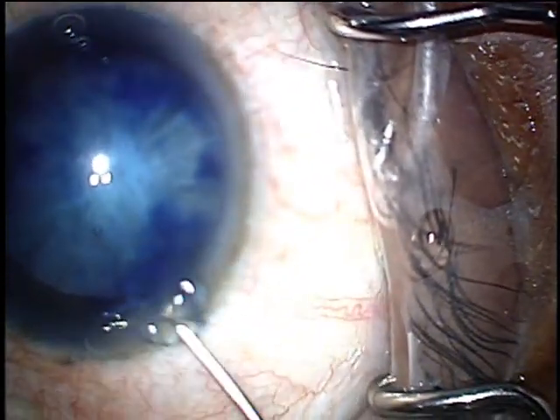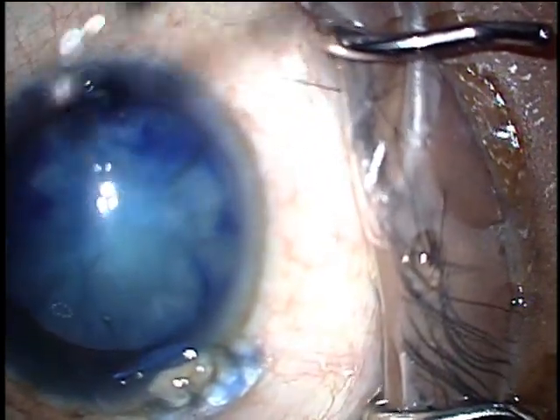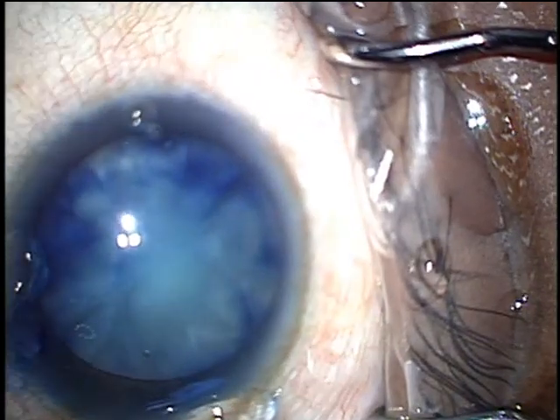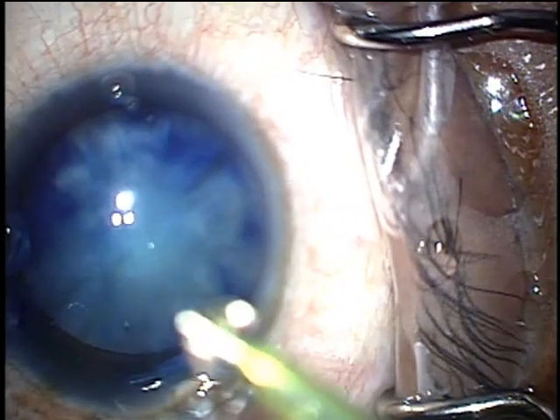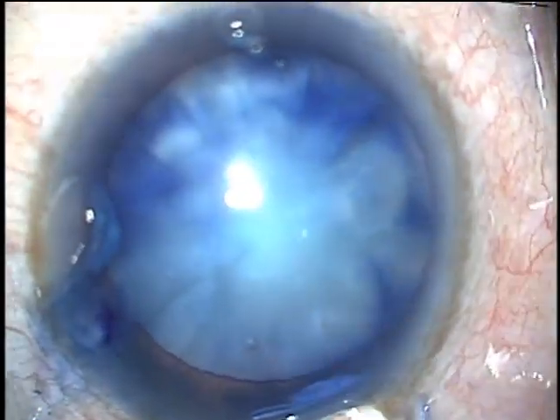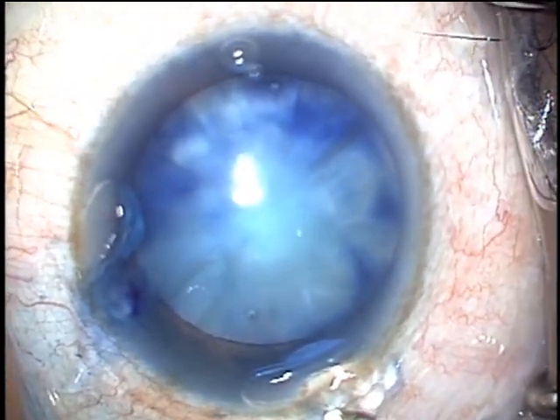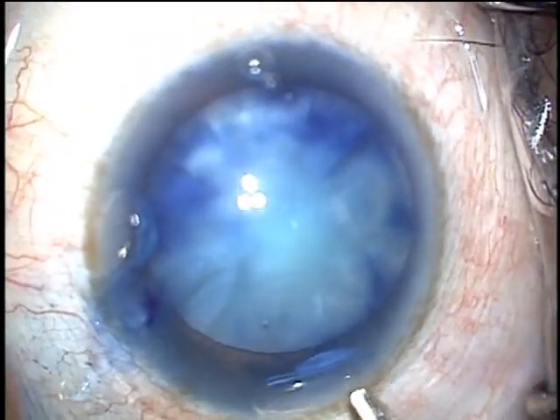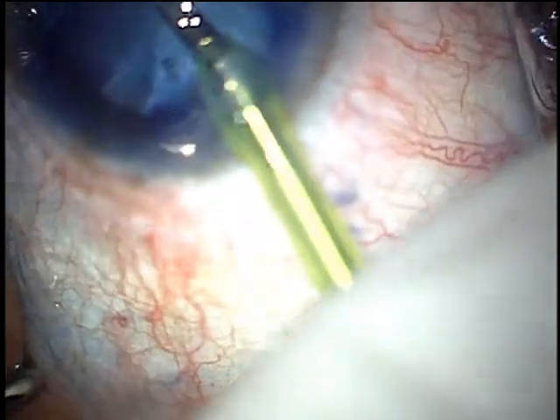Here I'm just injecting a little more viscoelastic. I will take my FACO probe and enter the anterior chamber. You can do that either with irrigation or without, in setting 0 or 1. Rest the tip bevel up against the anterior capsule. Go to position 2, irrigation aspiration, to create an island of saline under your viscoelastic and prevent a corneal burn.